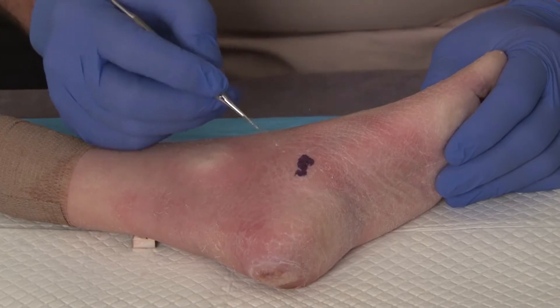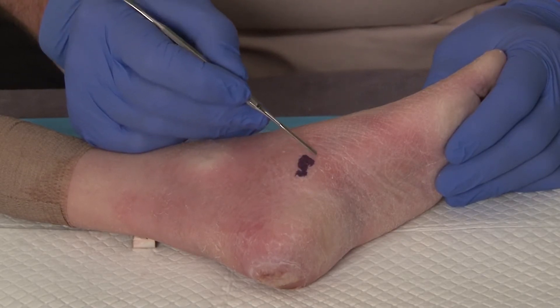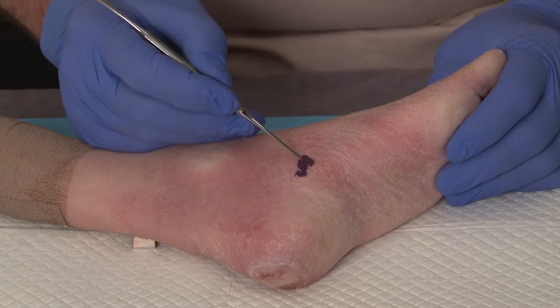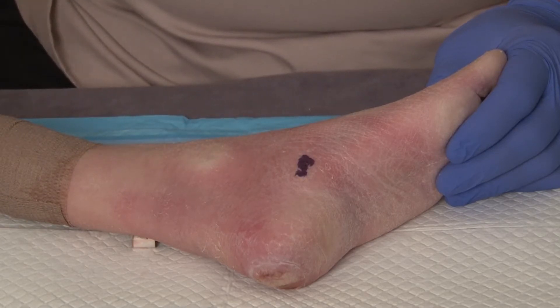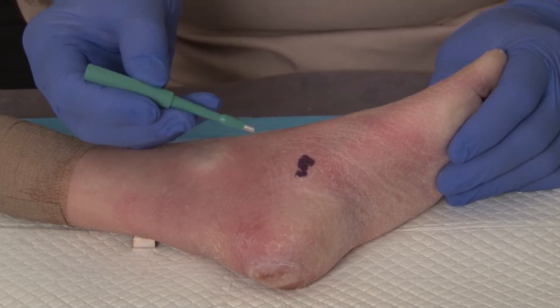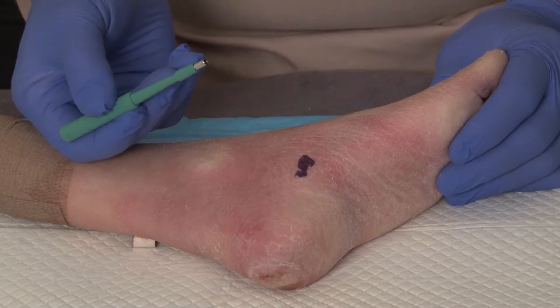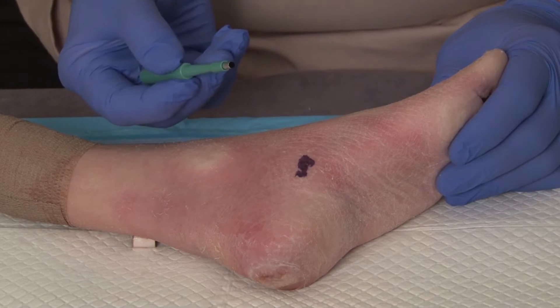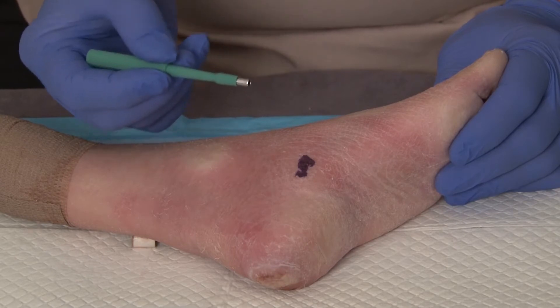With this technique we're looking at a potential lesion that we don't know what it is, and the idea is we're going to take a small specimen of this lesion for biopsy. In this particular scenario we're going to utilize a punch biopsy instrument. This happens to be a 3.5 millimeter diameter biopsy, but we could use a 2.0, 2.5, or 3.0 — whatever size we think is indicated for this particular lesion.